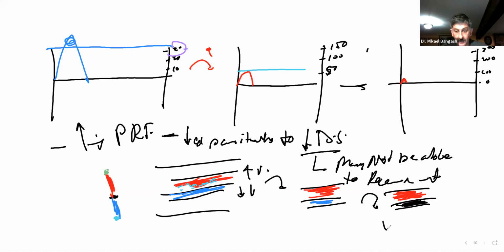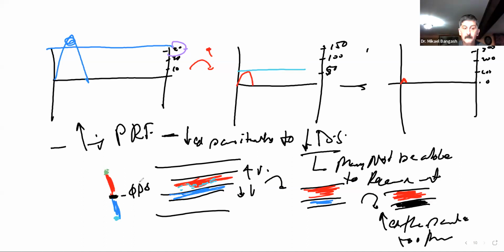So we can say we increased the scale too much, because now it increased to a level that it was not going to be able to record these low Doppler shift velocities here. And they actually will be represented as a zero Doppler shift.